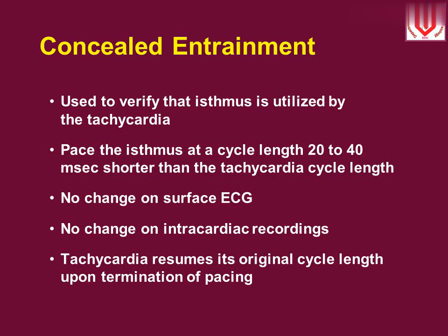By pacing near the critical isthmus, entrainment pacing techniques can be used to verify that the isthmus is utilized, and therefore can be ablated. Concealed entrainment is observed when pacing at the critical isthmus. No changes should be observed in the flutter pattern on the surface ECG or the intracardiac recordings. The tachycardia will return to its original cycle length after termination of pacing.